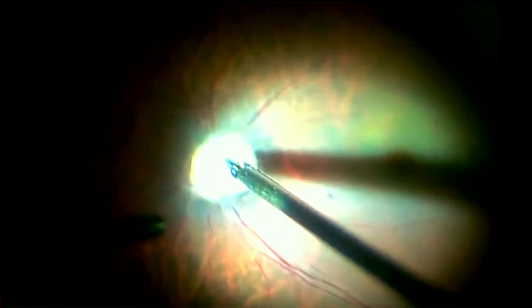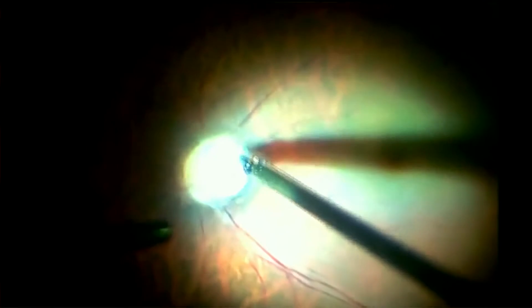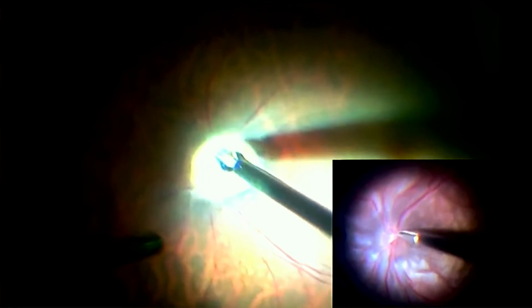The arterial sheathotomy with the dissection of the central meniscus of Kunt was done very carefully from center to periphery in a radial fashion. The optic disc dissection is not seen very clearly in this surgery since a light pipe was used instead of a chandelier. Hence, the inset shows a similar step done in another case using a chandelier. This dissection also helps us to massage the central retinal artery directly.